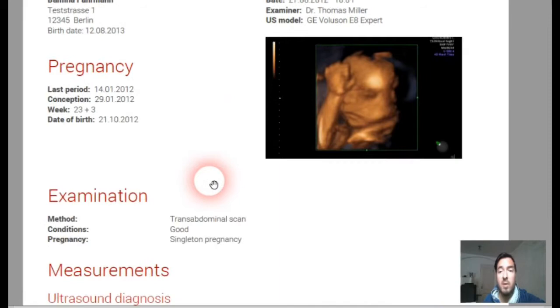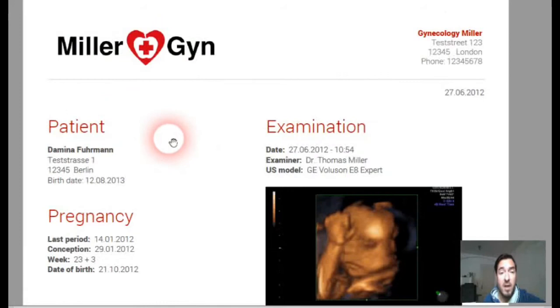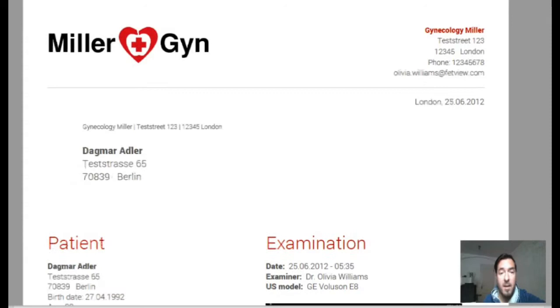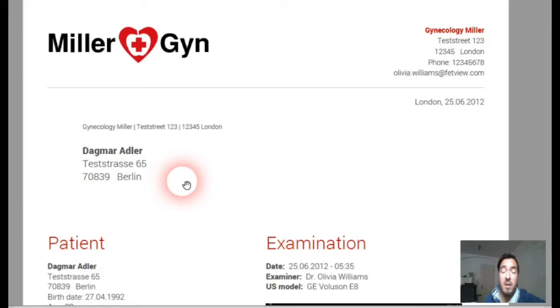The first one is the normal, classical report with all relevant information for the pregnancy or gynecological examination. The second one includes the address field of the patient with the patient data, and the same is available for the doctor.